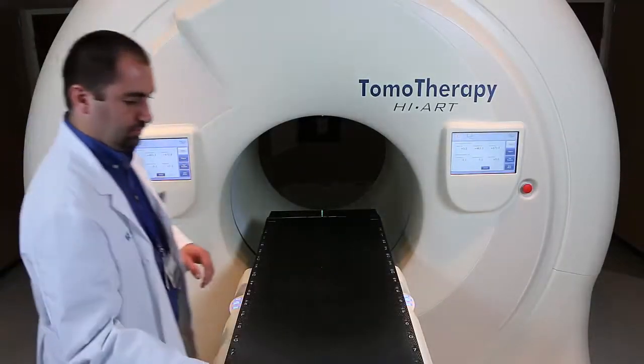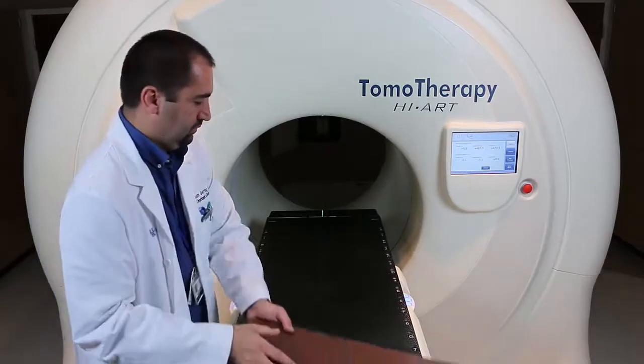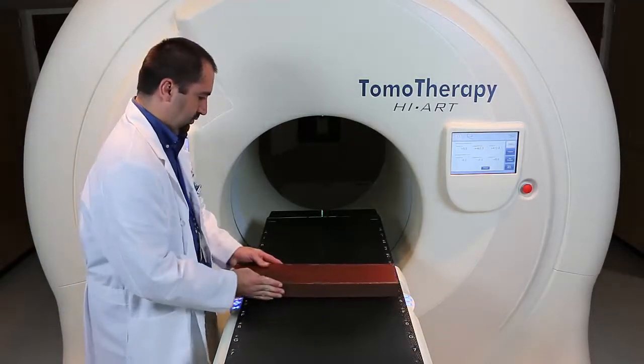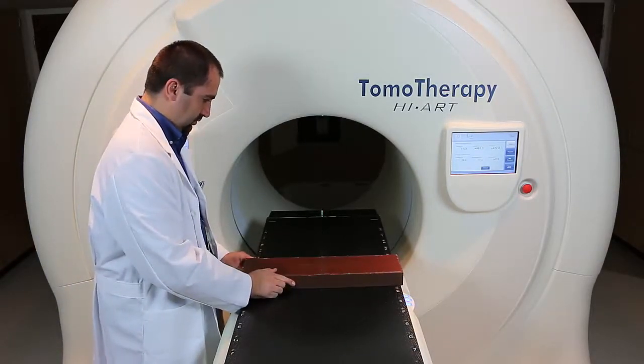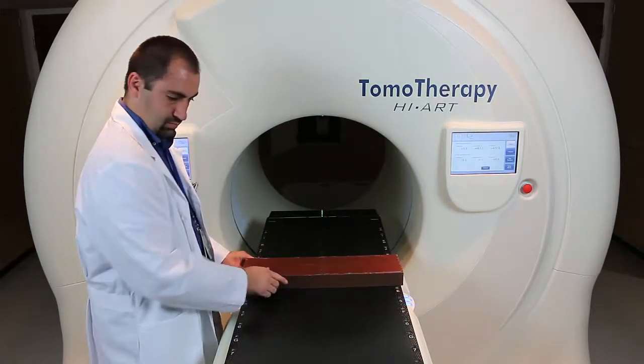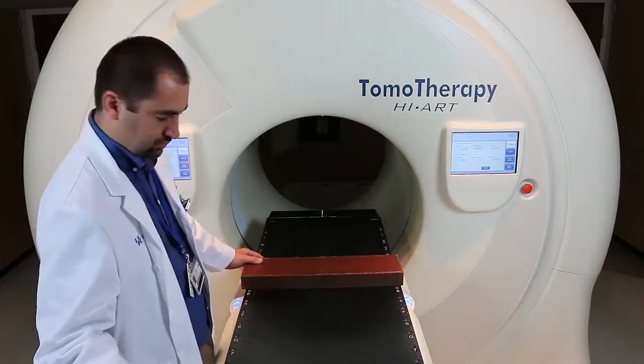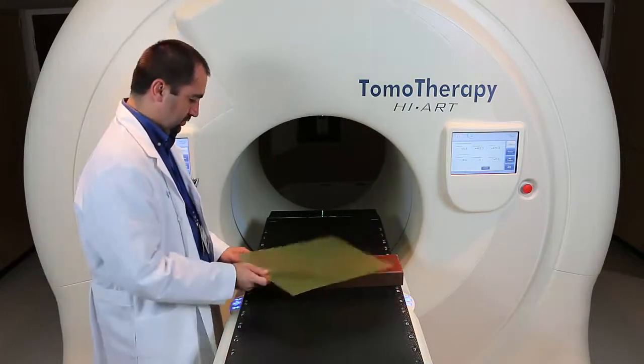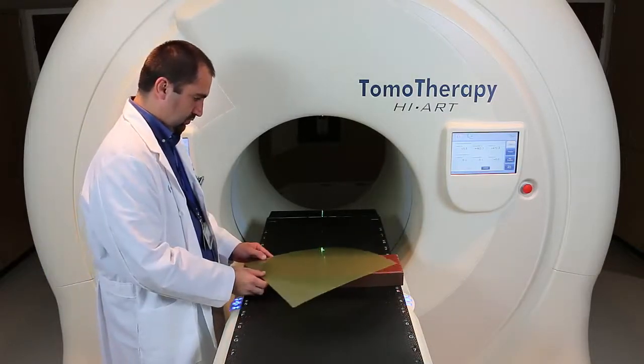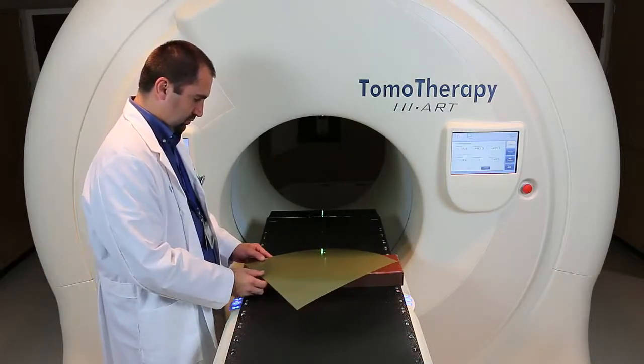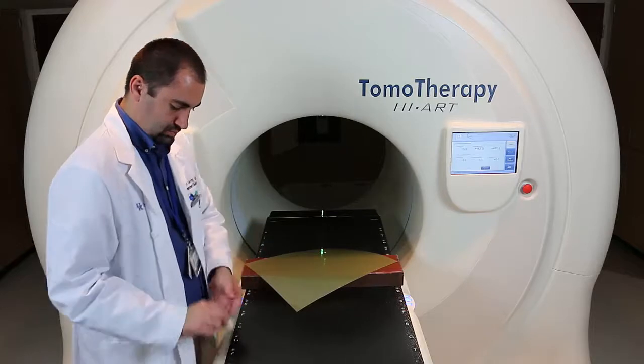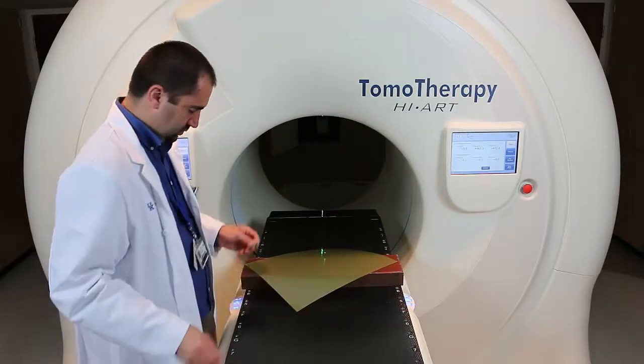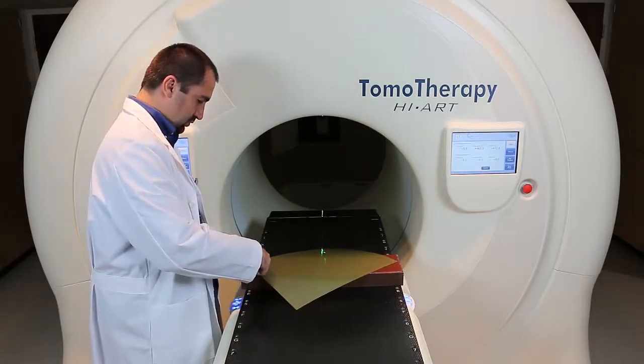This is a video on how to do the overhead laser alignment QA for a tomotherapy. We're going to start by setting up a 5cm piece of solid water with a piece of film laying diagonally across the solid water.